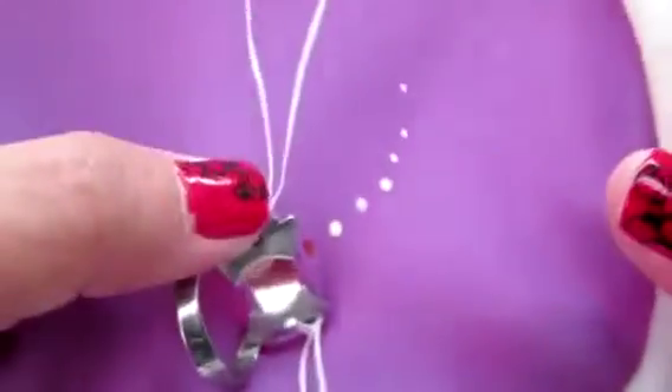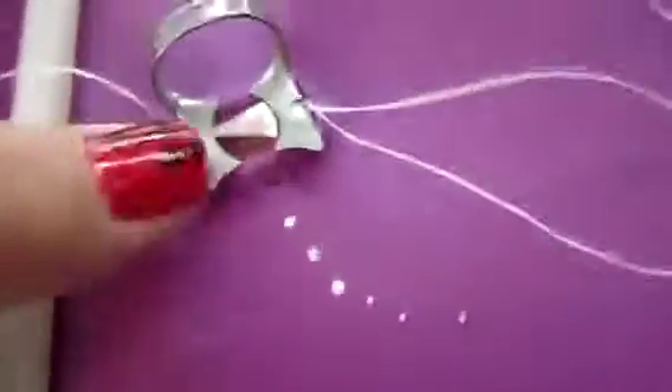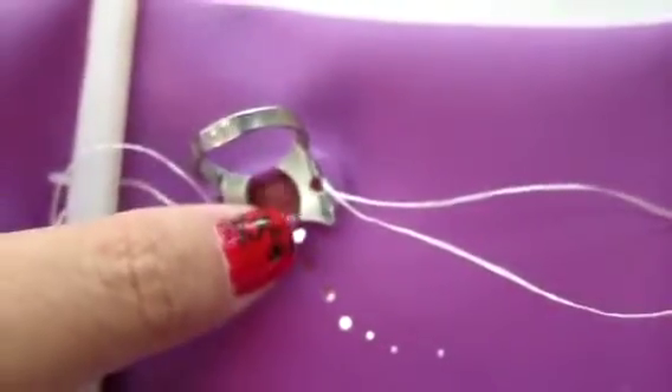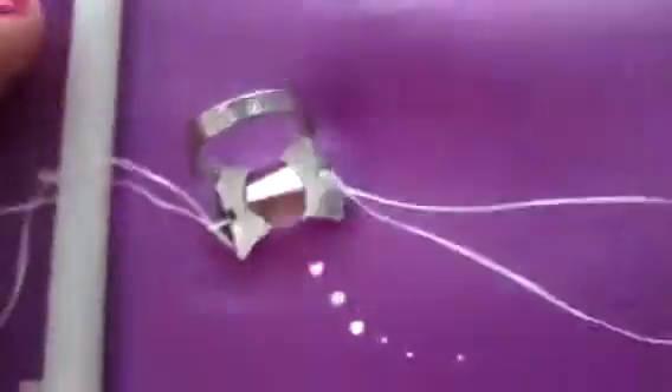Also you're going to need your rubber dam. I like to have my rubber dam nice and set up: holes punched, floss ligated to the clamp, clamp in the rubber dam, and the frame already attached. That way when you go to start, you can go ahead and put this all on in one piece without trying to fiddle with it.